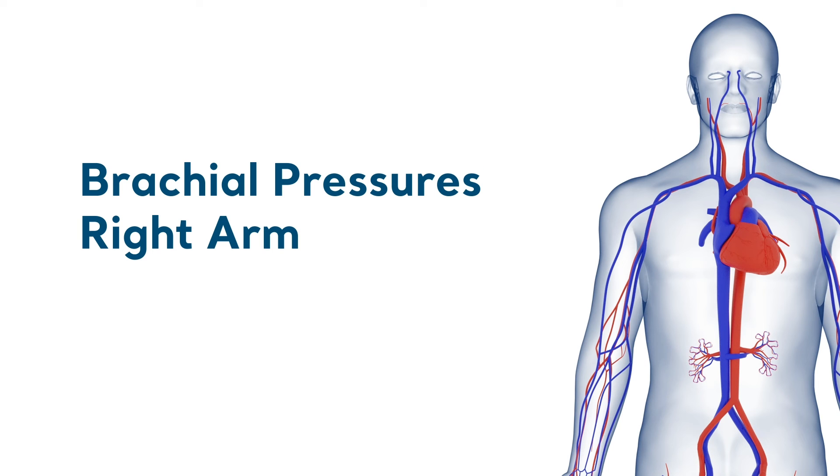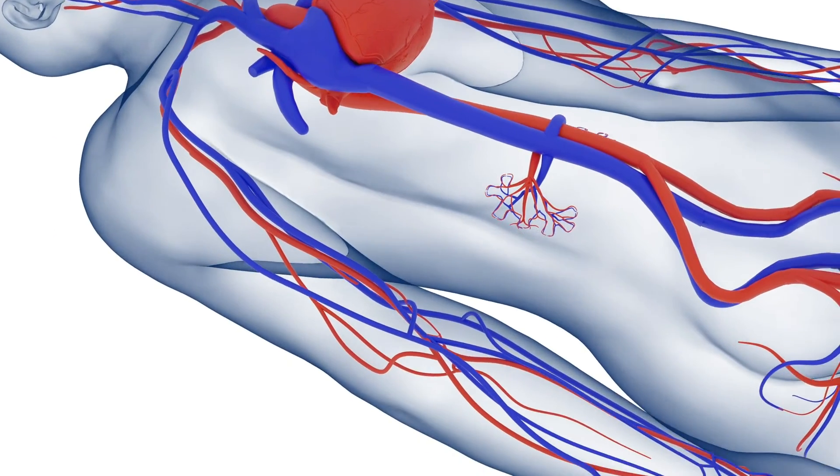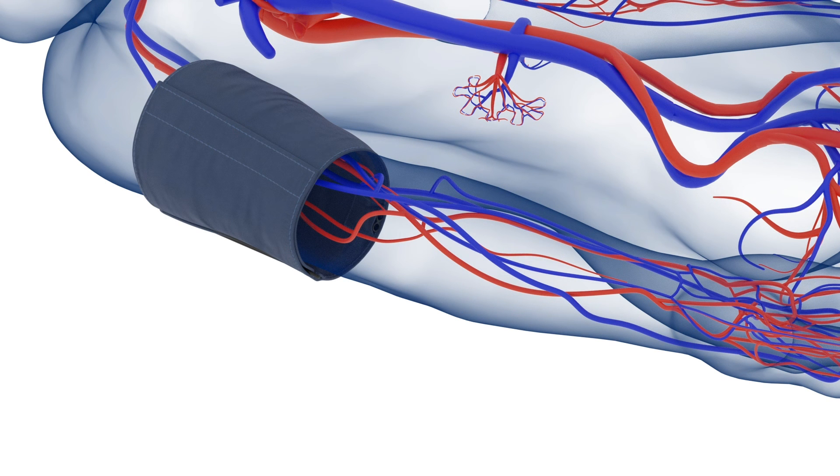Using the Doppler, first the brachial systolic pressure is determined in both arms. Making sure the patient is relaxed and comfortable, the cuff is placed around the arm. Palpate the brachial artery and then apply gel.